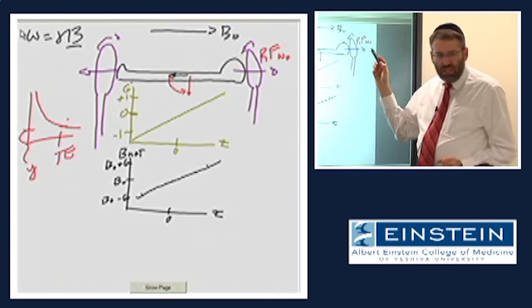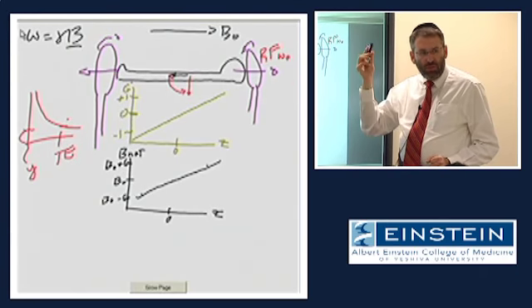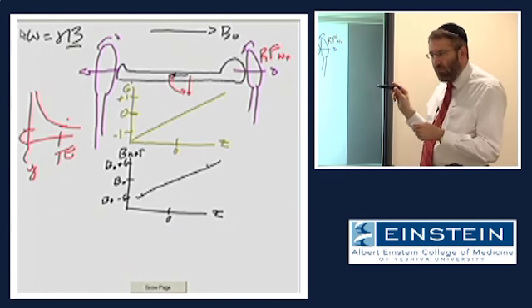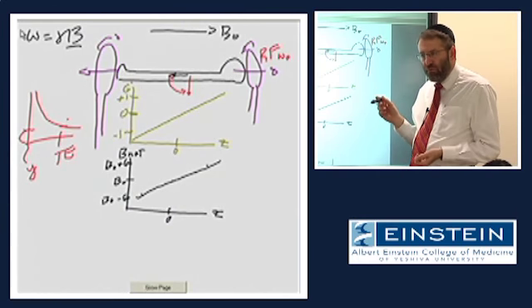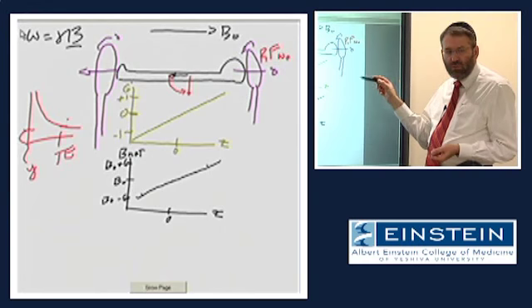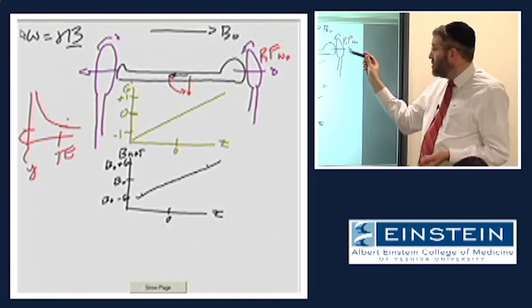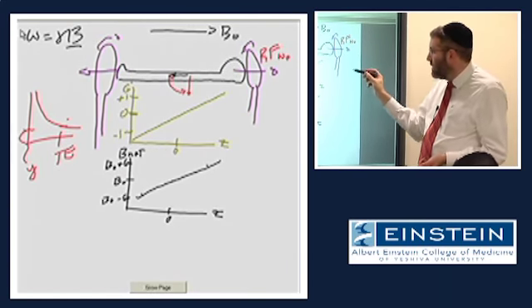Resonance only exists where there's a match between the frequency of rotation of the RF and the frequency of precession of the spins, right? If we have spins that for whatever reason are precessing at a different frequency, there's no resonance, there's no efficient transfer of energy, and there's going to be no flip of that magnetization, right? Choosing this frequency at which we transmit the RF is essential.